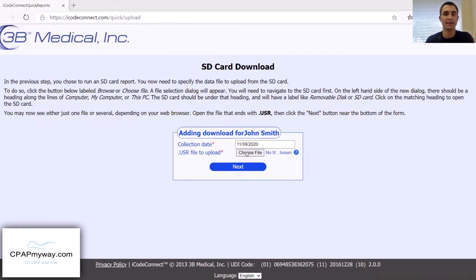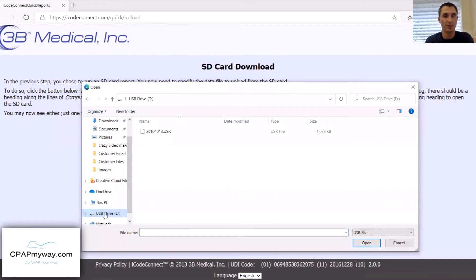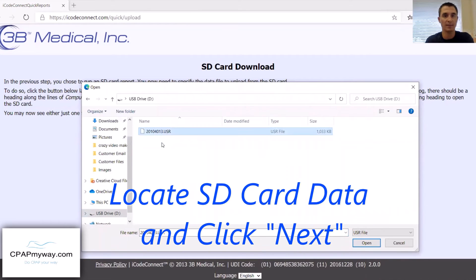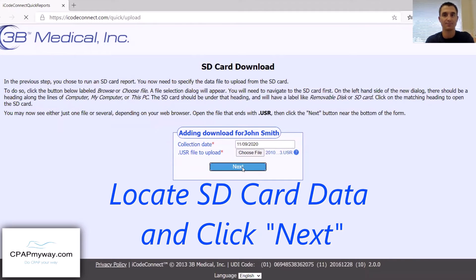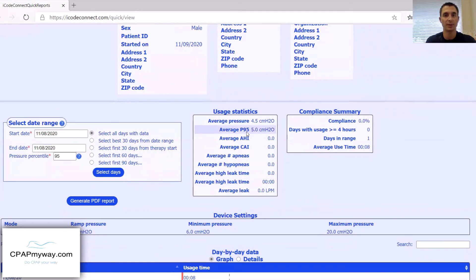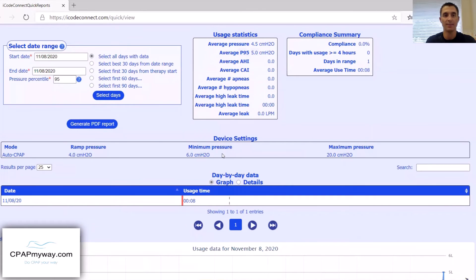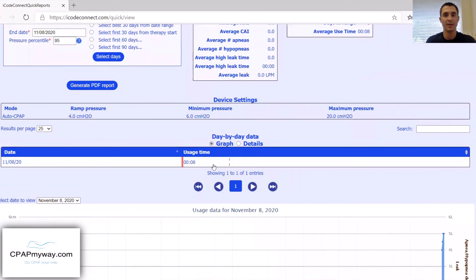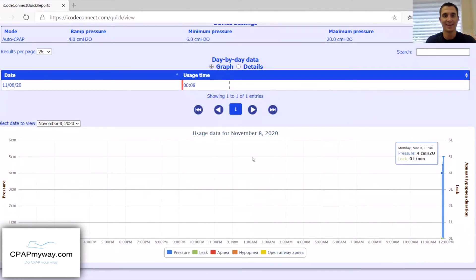From here, you're going to find the SD card. I put it in my USB drive — double click on the data and hit Next. Once you do that, it pulls up a nice compliance summary. You'll be able to look at your usage statistics, your compliance summary, everything about your device settings, a day-by-day breakdown. Today I used it for eight minutes, and then there's a nice breakdown of the usage.